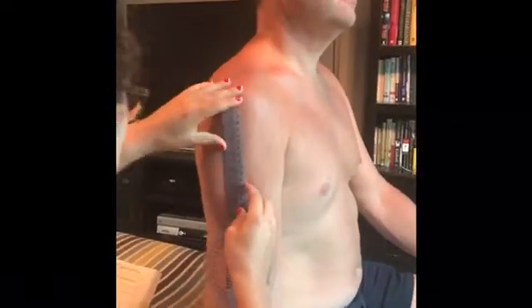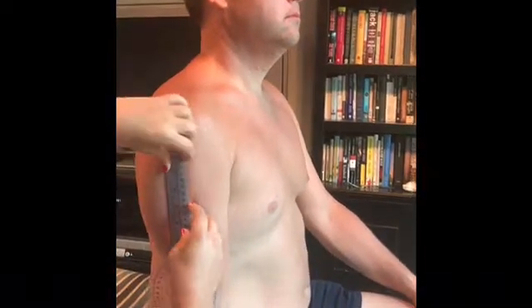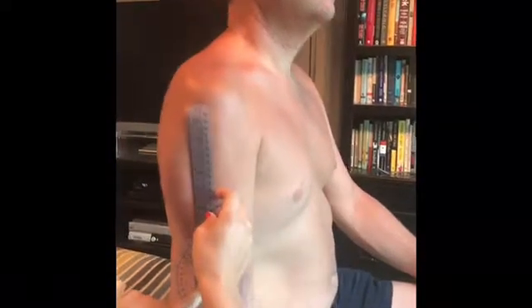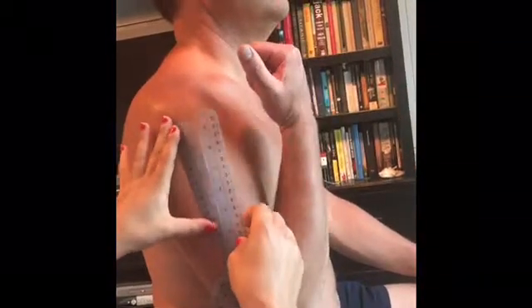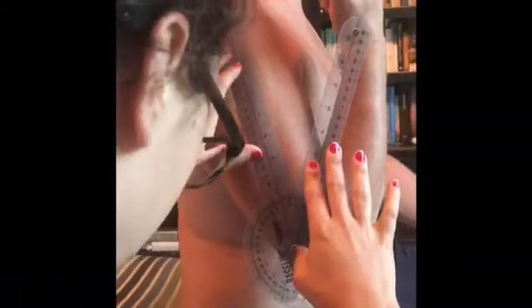Okay, so we're going to be measuring the range of motion of the elbow flexion. Typical range of motion is 0 to 140 degrees. The axis is going to be on the lateral epicondyle of the humerus. The moving arm is going to be midline of the radius, and the stable arm is going to be midline of the humerus. So go ahead and flex your elbow. And it is at 145.